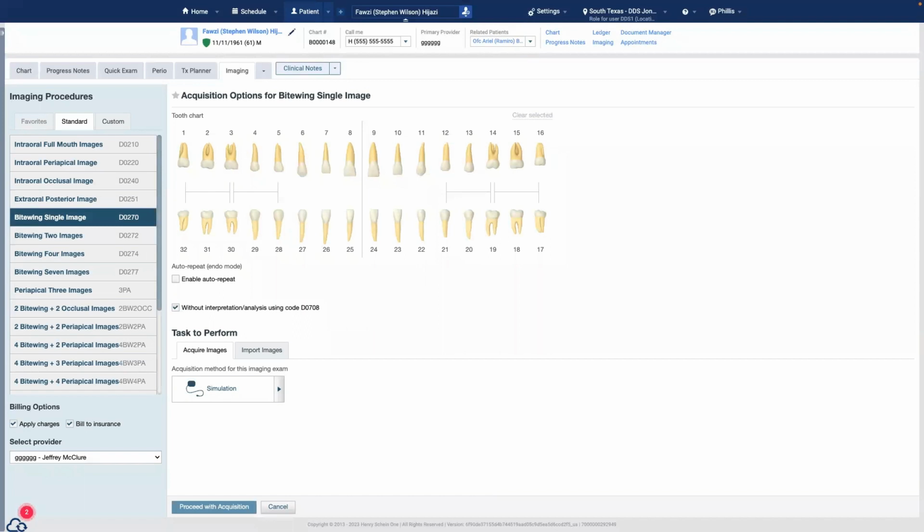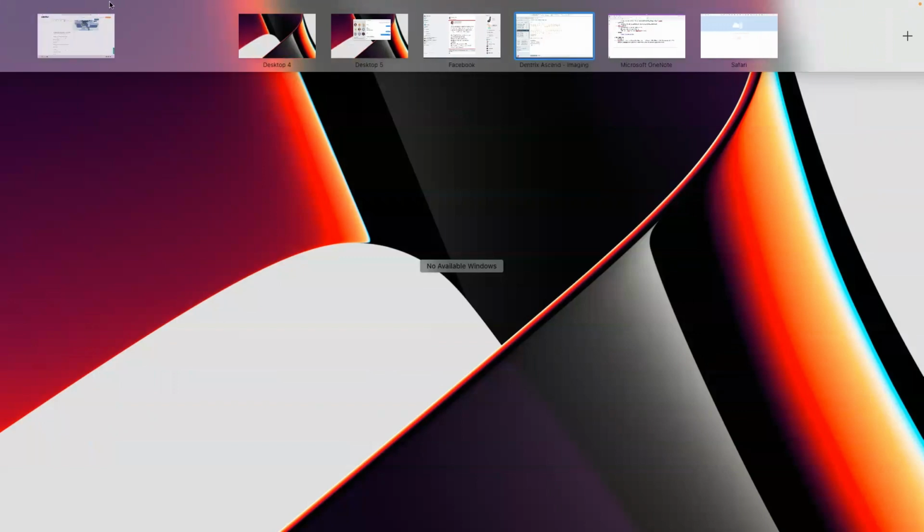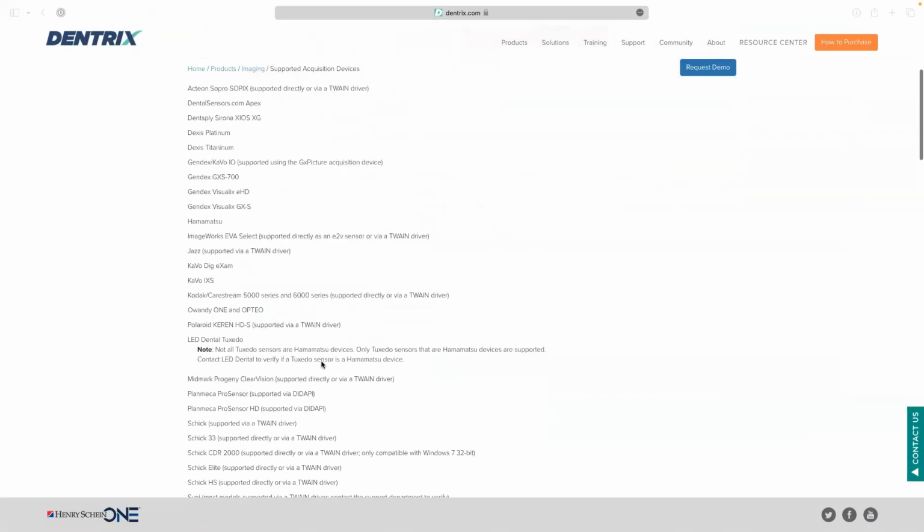With the Twain software, you're at the mercy of the filters the manufacturer of that sensor gives you. The direct integration is when the imaging companies, such as the Real Cloud Imaging that does the imaging for Dentrix Ascend, use the best available filters to give you the best end result. And that's what Adam is looking for, to see who can directly integrate with Dentrix Ascend. And I think almost everything, right?